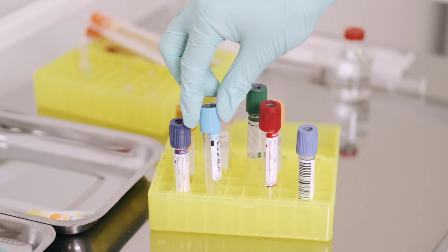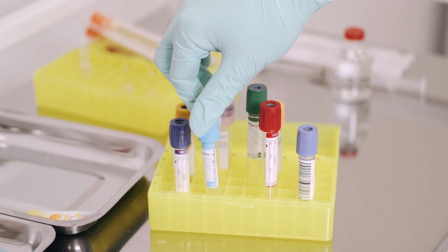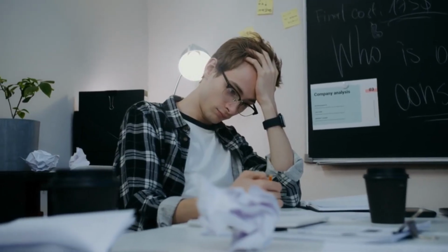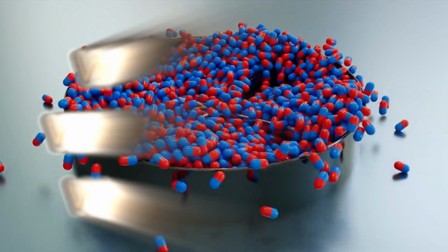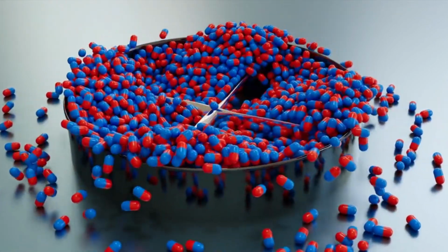Another example, if a blue coagulation tube is filled after a serum tube, the clot activator might enter the blue tube, leading to incorrect PT or APTT results. In short, wrong order equals wrong chemistry, wrong results, and possibly wrong treatment.